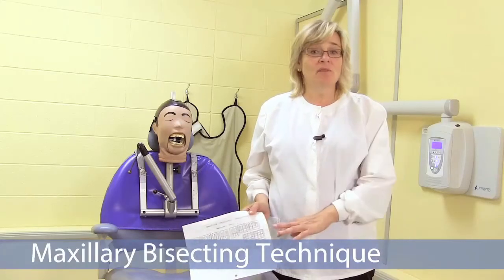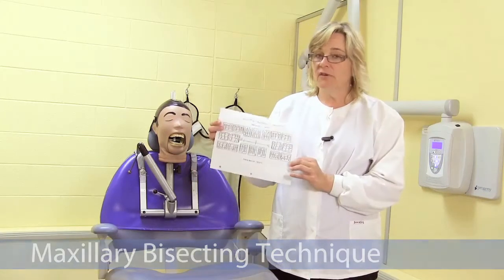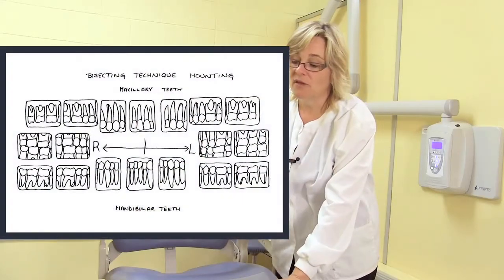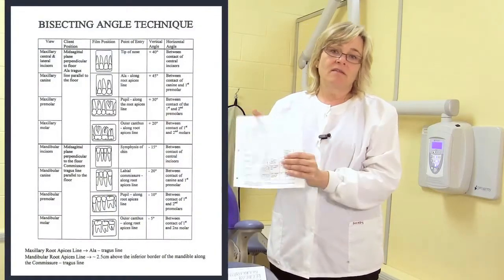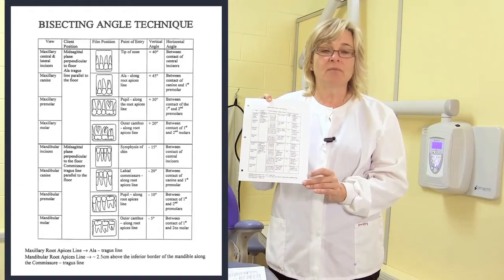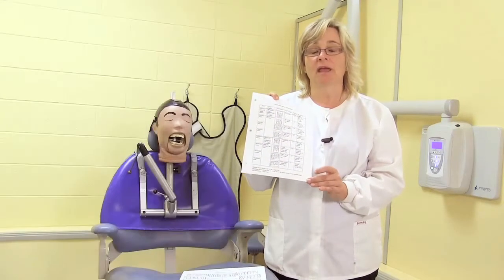Okay, today we will be demonstrating the maxillary bisecting technique. I'd like you to refer to and use in clinic the two most important handouts that we gave you. One is a schematic of a bisecting full mouth series. The other is a schematic of the angulations required for taking specific shots in the bisecting technique, both maxillary and mandibular.